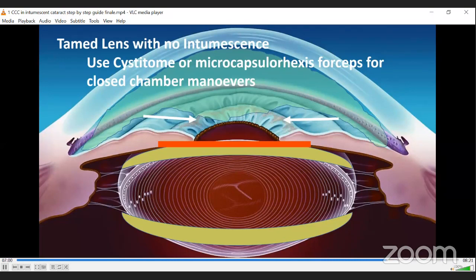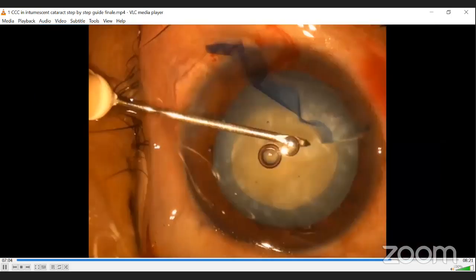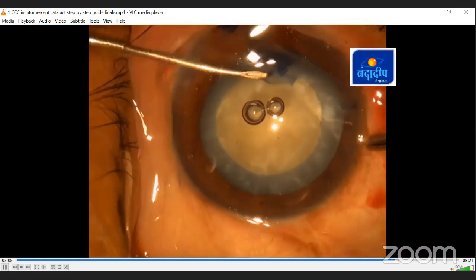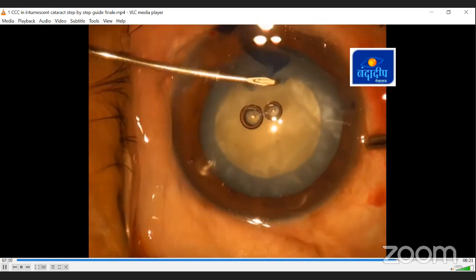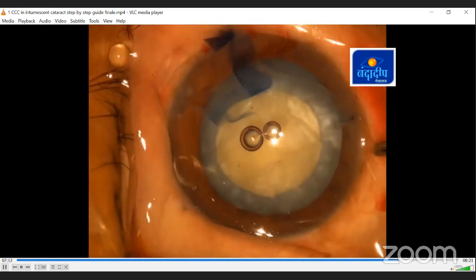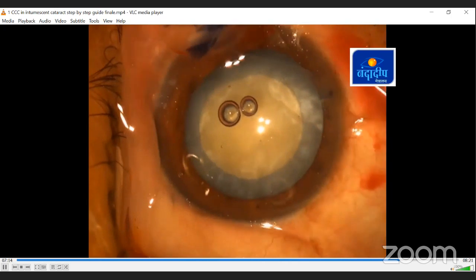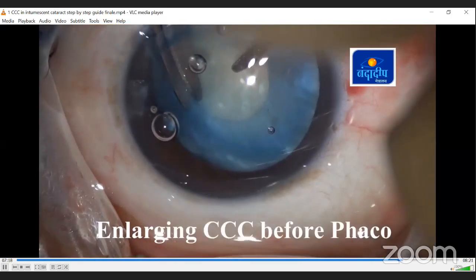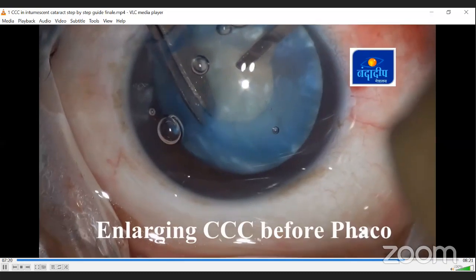And again, if you remember the first principle, if the anterior capsule is flat rather than convex, the outward forces on your capsulorhexis edge are less. So once you flatten the anterior capsule, you will find that it is much easier, even than a normal cataract, to do CCC in intumescent cataract.